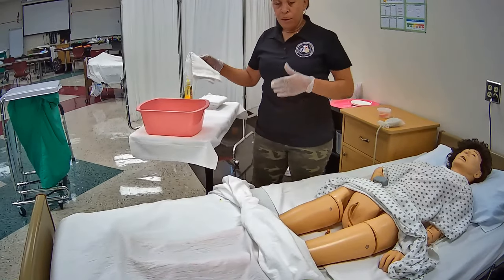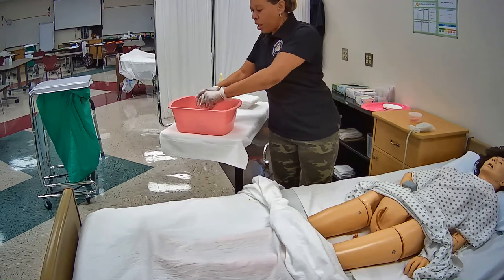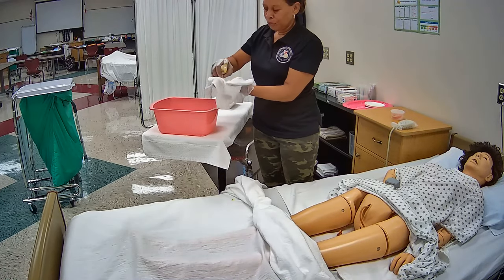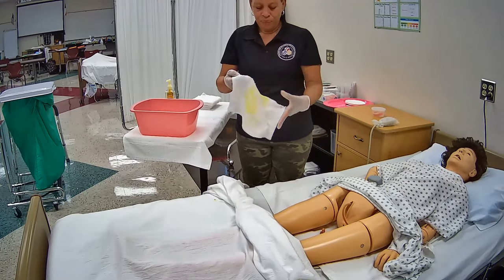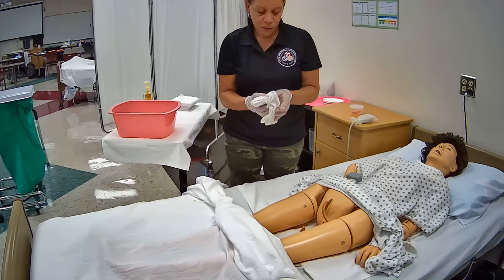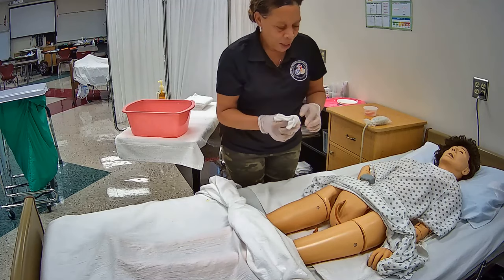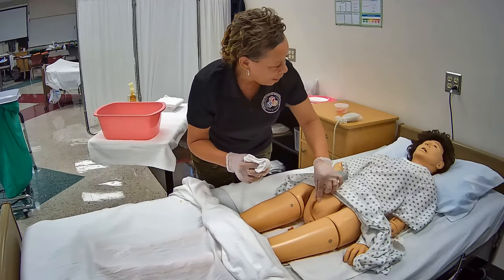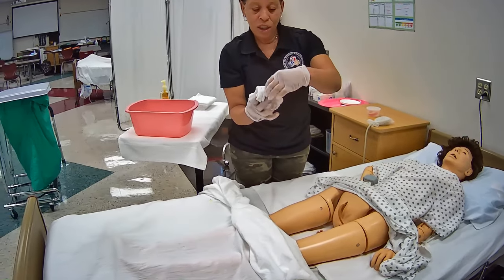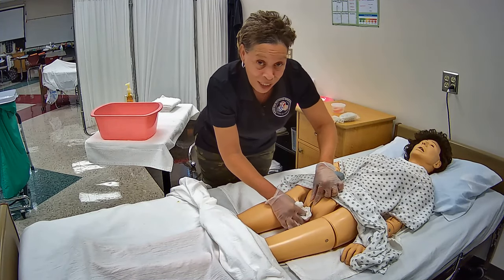With this skill, you have to clean the inside of the labia. So the first washcloth I'm going to wet and squeeze out really good because I don't want any water dripping. I'm going to apply soap and get it over all of the washcloth. I'm going to fold the washcloth and hold it in my hand so no part of it is dangling. Mrs. Jones, I'm just going to clean your labia now, so you're going to feel me touch you. I'm going to clean the inside of the labia furthest from me, then flip to a clean area of the washcloth and clean the inside of the labia closest to me.